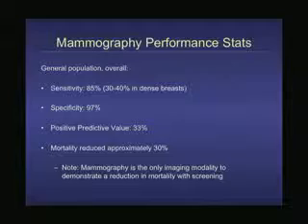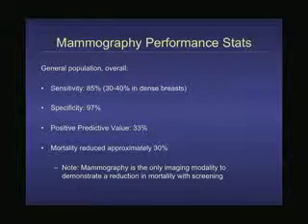All right? And we know from many randomized controlled trials looking at different populations, where one set of the population got screening mammography and another set didn't, that over a long period of time we can reduce mortality, or death from breast cancer, by about 30%. Okay? And mammography is the only imaging modality out of these three that I talked about for which those types of studies have even been done, looking at mortality reduction.